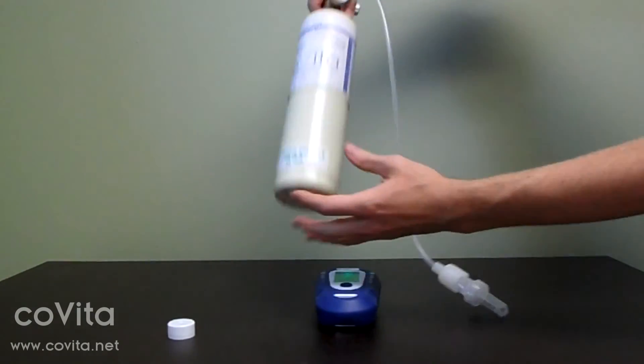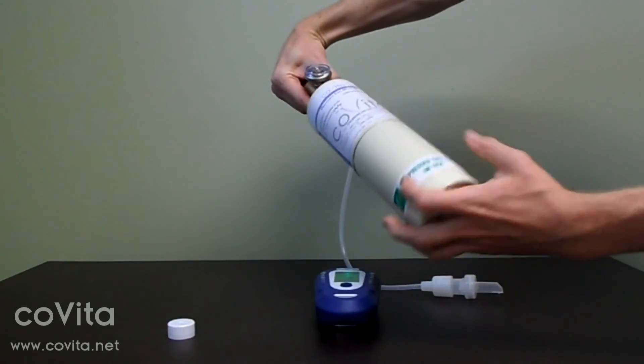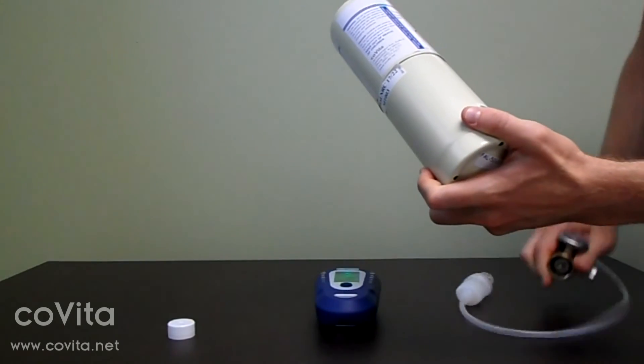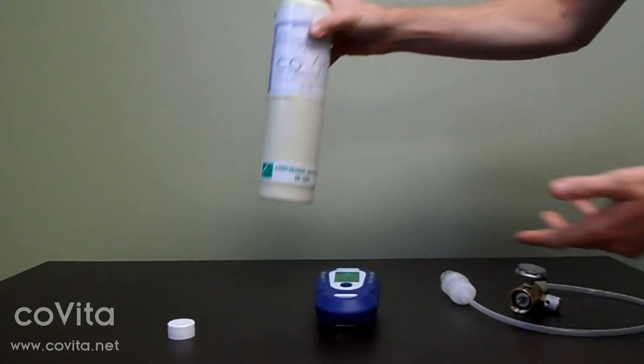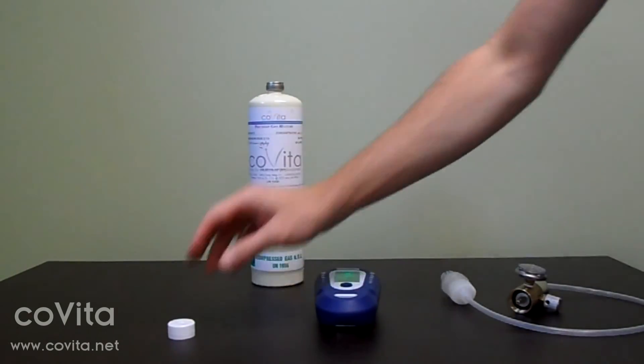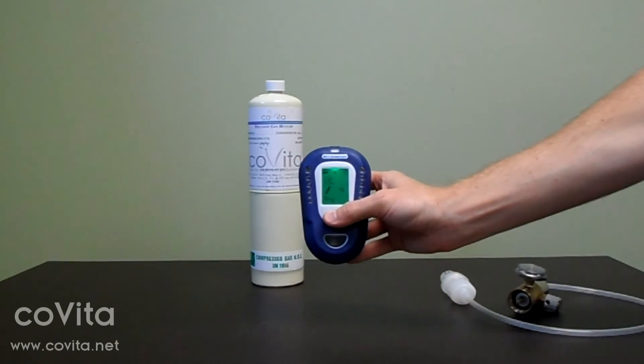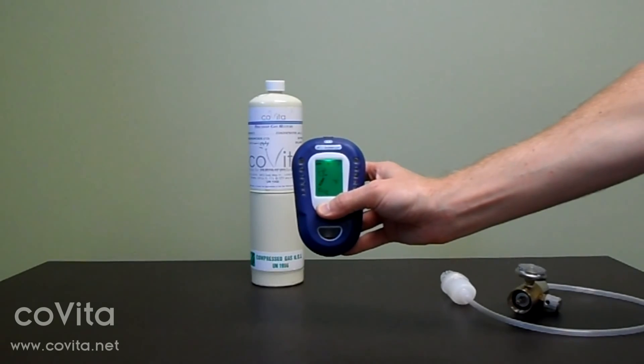In order to prevent gas from leaching out, be sure to disassemble your calibration kit when you're finished. Unscrew your regulator from the can. You can leave the calibration adapter connected to the top of your regulator. Finally, replace the dust cap to the top of the can and store your calibration kit in its original packaging.